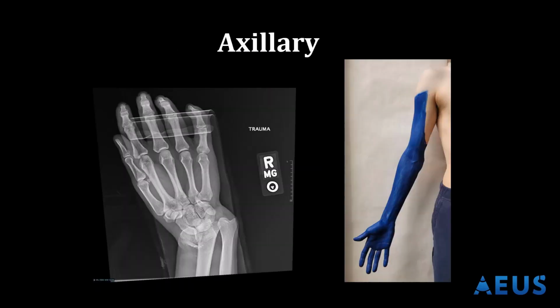This case gives us an opportunity to discuss the final brachial plexus block, the axillary brachial plexus block. Don't confuse this with the axillary nerve block we talked about before in the shoulder block part, because that was the peripheral axillary nerve. This axillary brachial plexus block is an approach to the brachial plexus at the terminal branches as they travel with the axillary artery in the brachial plexus sheath. By this point, the musculocutaneous nerve has already branched off laterally, so that means you have a second target and injection site. But this block will provide analgesia to the distal arm, the elbow, the forearm, and the hand.